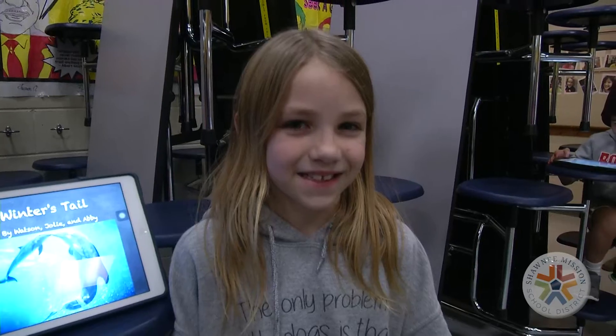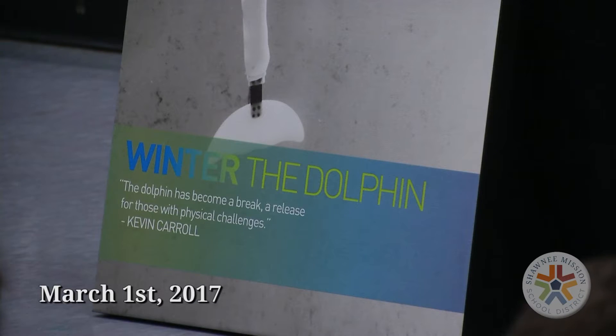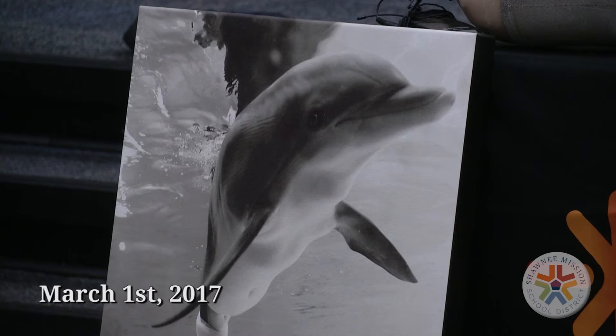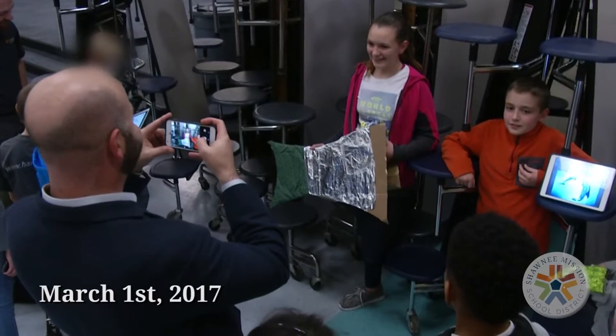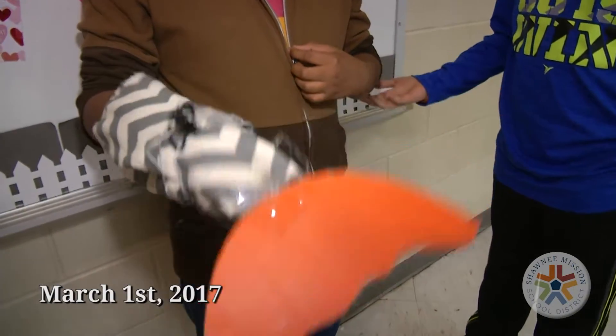About a month ago I received an email from Mrs. Overton. Her fifth grade class had recently finished a reading assignment on the book Winter's Tail and had her students break into groups. Those groups ended up designing prosthetic tails of their very own for Winter the Dolphin.